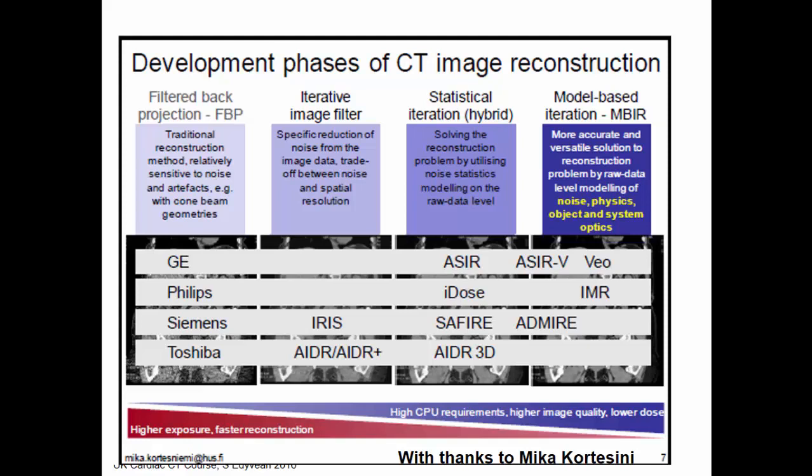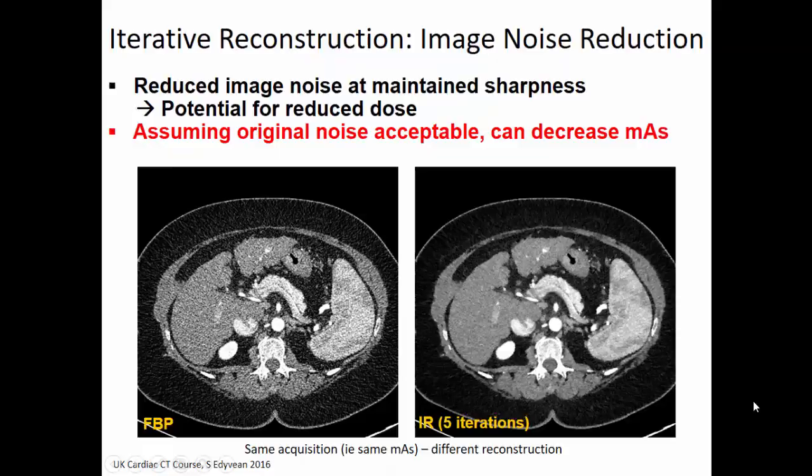And so there's this constant balance between whether you wait 20 minutes for a very, very good image, which is what some of the early versions of the software did, or whether you're happy to stay back in this level. Now, one of the advantages, as I said, by using more of the data, is that you're reducing the noise in the image.